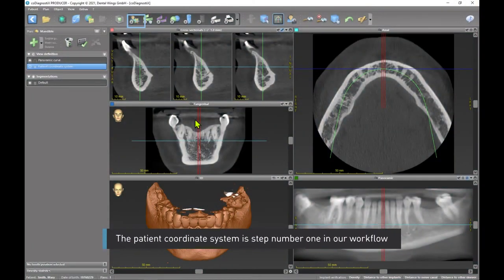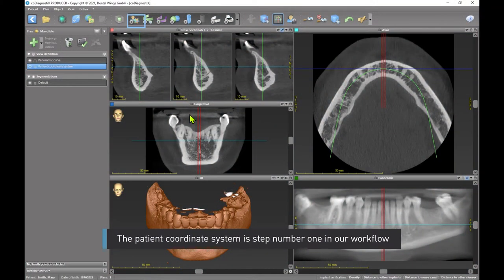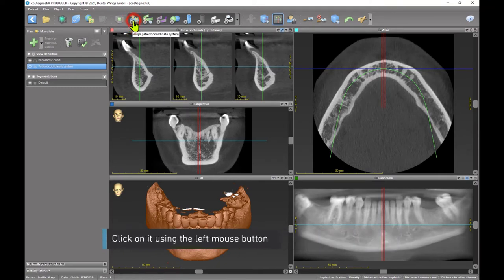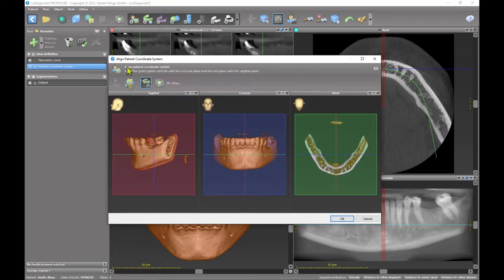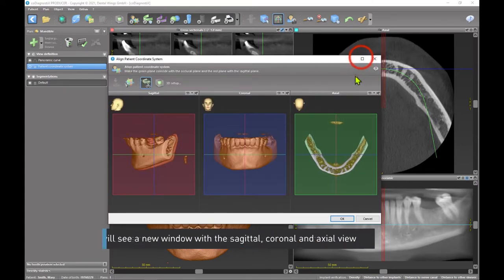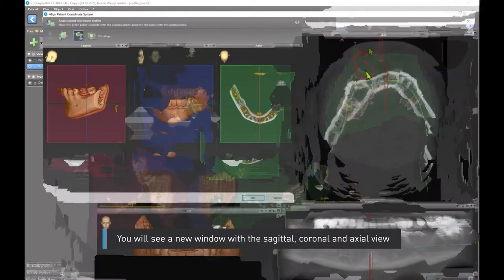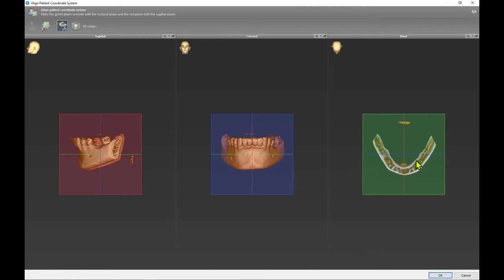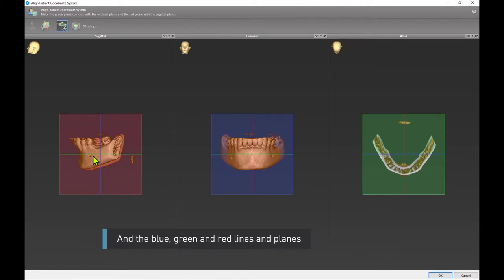The patient coordinate system is step number one in our workflow. Click on it using the left mouse button. You will see a new window with the sagittal, coronal, and axial view and the blue, green, and red lines and planes.